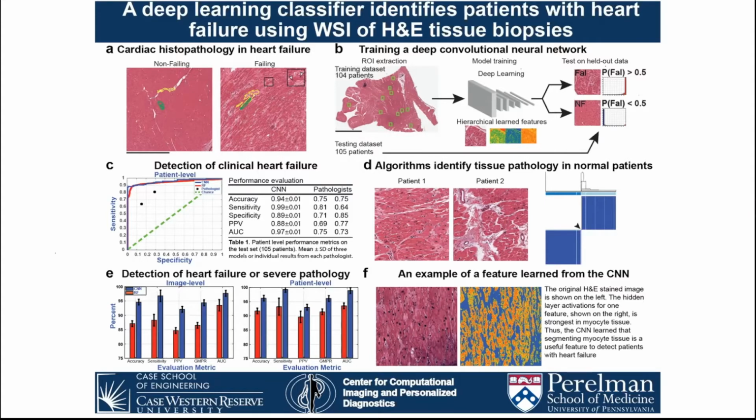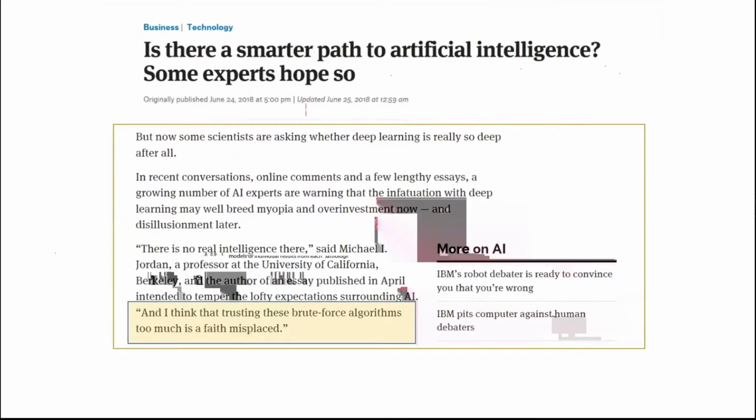So this is one of the challenges, right? The message here is that we need to be aware that these deep learning algorithms have this issue of transparency. There is an opacity associated with these representations, and that was a real, enlightening study for us, because we realized that when you don't understand the inner workings of the algorithm, then when something breaks down, it can be really tricky, really challenging to figure out what went wrong.